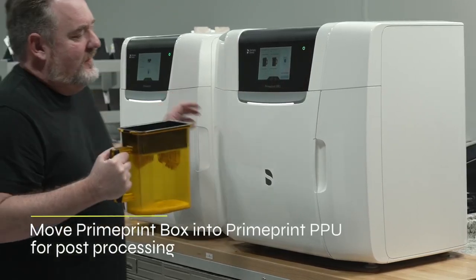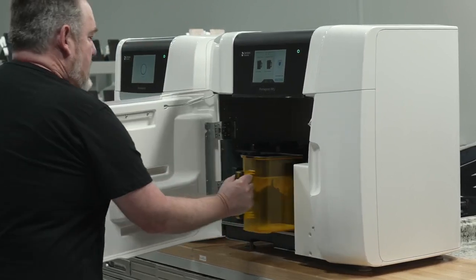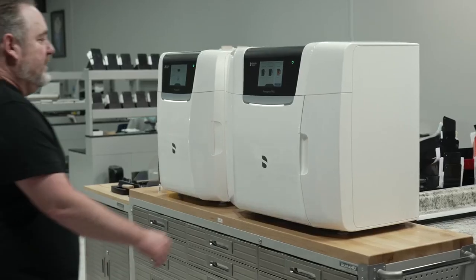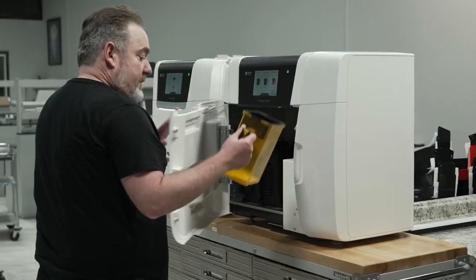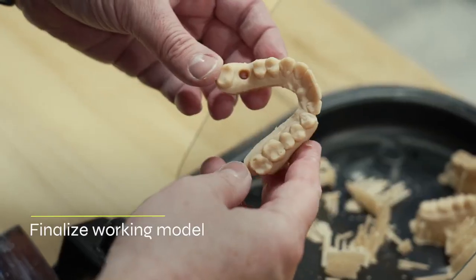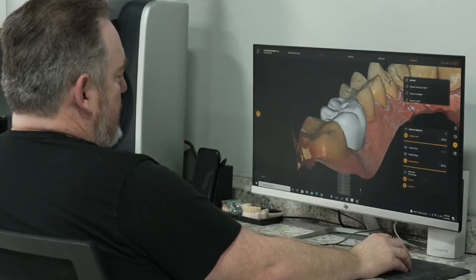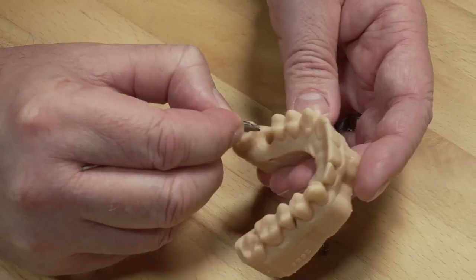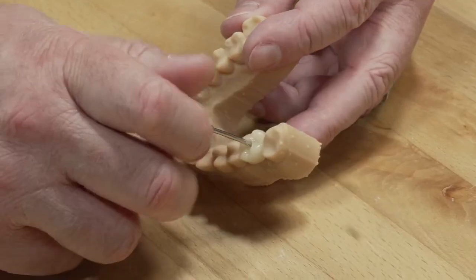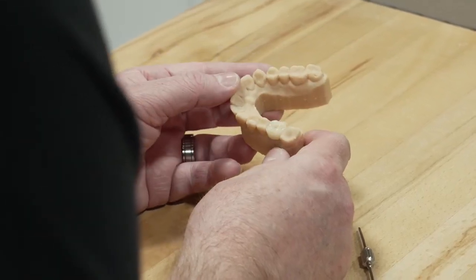The next step is putting it into the PPU, and you're not really getting yourself dirty — you don't have to wash your hands a thousand times or use alcohol to get material off your hands. Once it's done, you open it up and it's already cured, already clean, already dried for you. You just take all the sprues off, and your model is ready to go. Once you have that crown, especially if it's an implant case, you just put it in, screw it in, and you call it a day.